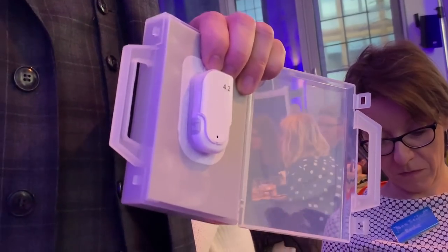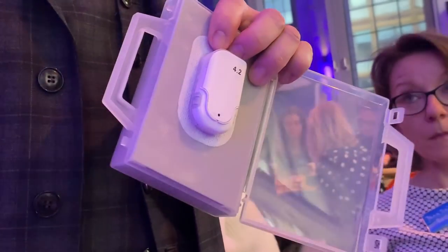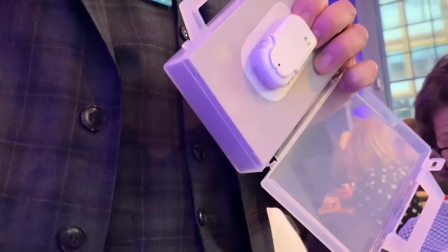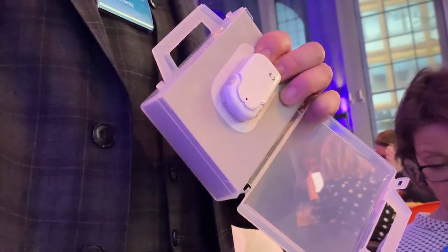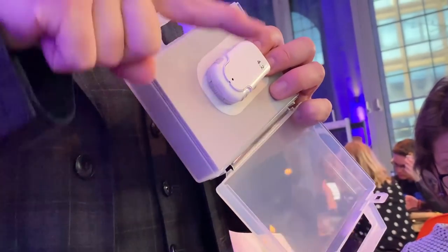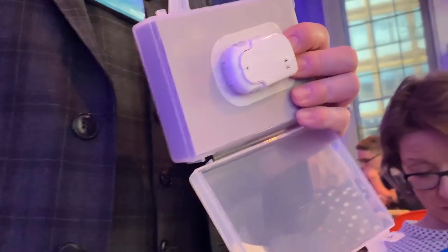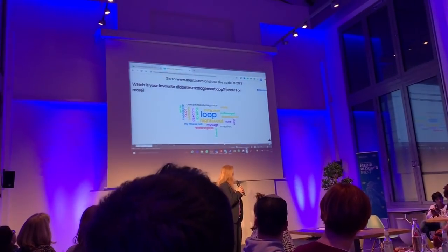Love this. And since the pump delivers with 2 units per minute, I have to talk now for 30 seconds, because in 30 seconds this bolus runs through. I want to show you that when the 30 seconds are over, you also, for a quick bolus, would get an acoustic feedback that the bolus has run through, so that really it is completed and the insulin is now in your body.